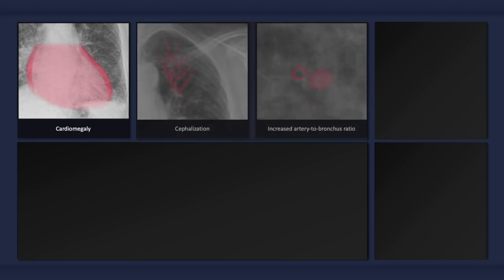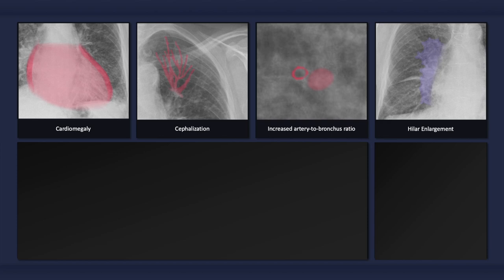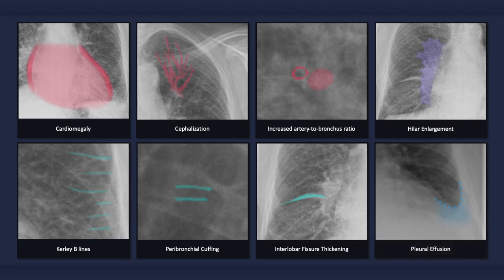To quickly recap, the plain radiographic findings that can occur with congestive heart failure include cardiomegaly; signs of vascular redistribution such as cephalization and increased artery-to-bronchus ratio in superior segments; signs of pulmonary vascular congestion such as hilar enlargement and a widened vascular pedicle; signs of pulmonary interstitial edema such as Kerley B-lines, peribronchial cuffing, and interlobar fissure thickening; pleural effusions; and in more severe cases, alveolar edema.